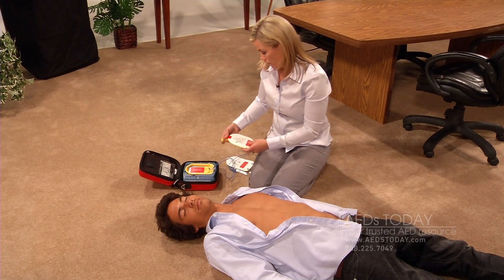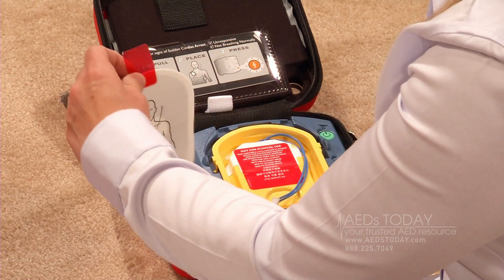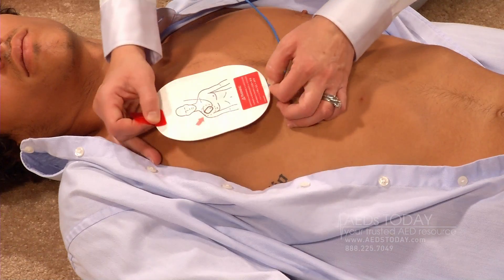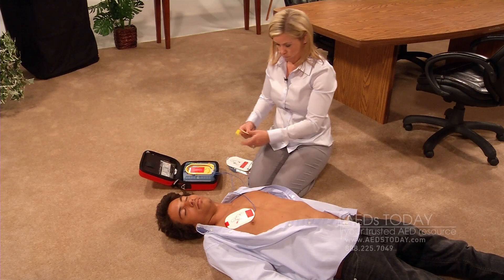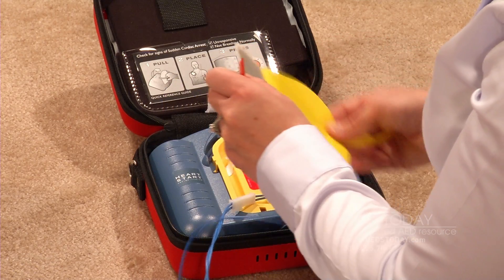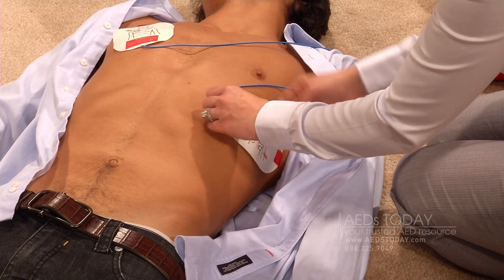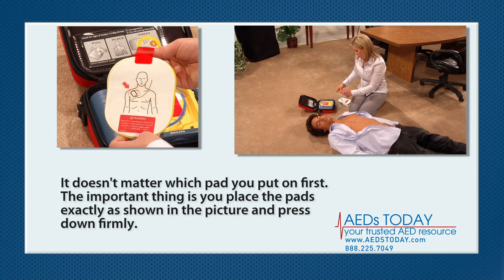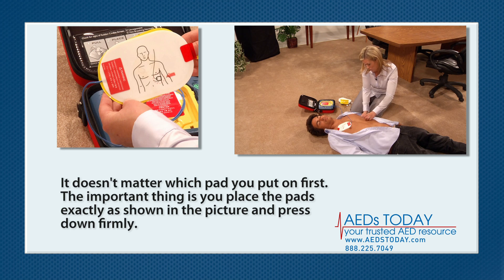Look carefully at the pictures on the white adhesive pads. Place each pad exactly as shown in the picture and press firmly to the patient's bare skin. It doesn't matter which pad you put on first. The important thing is that you place the pads exactly as shown in the picture and press down firmly.